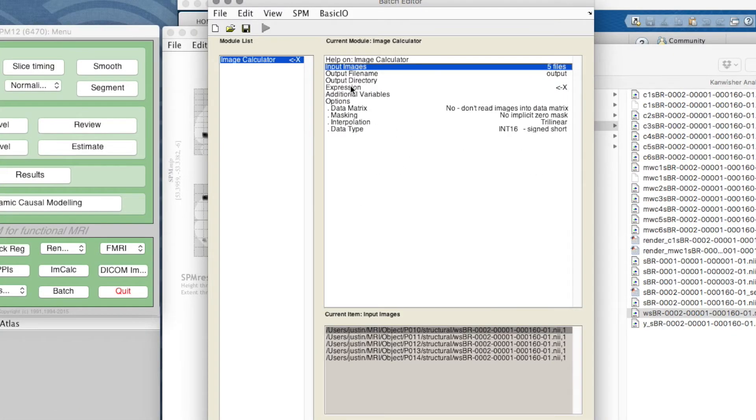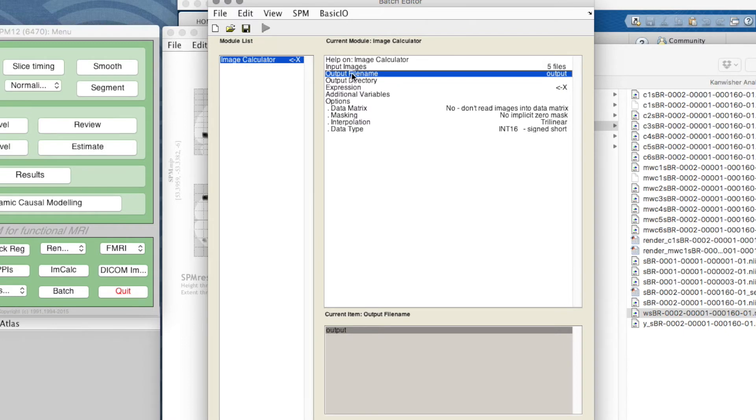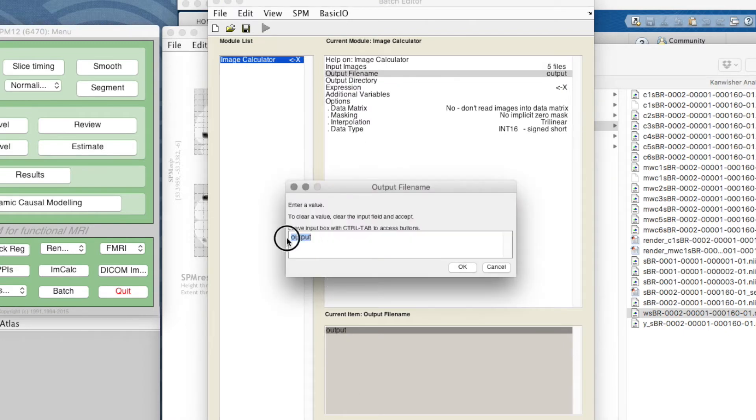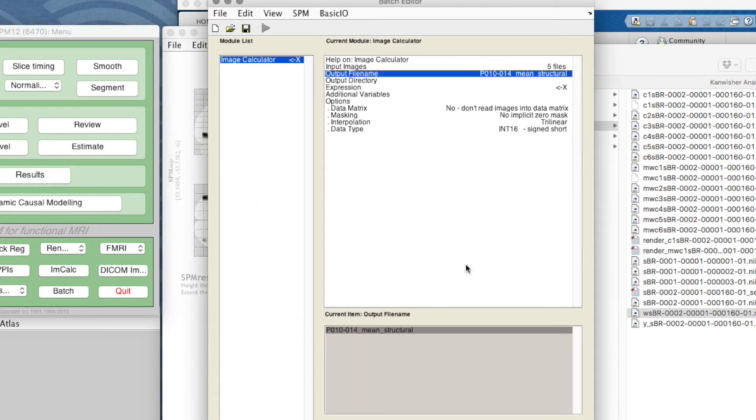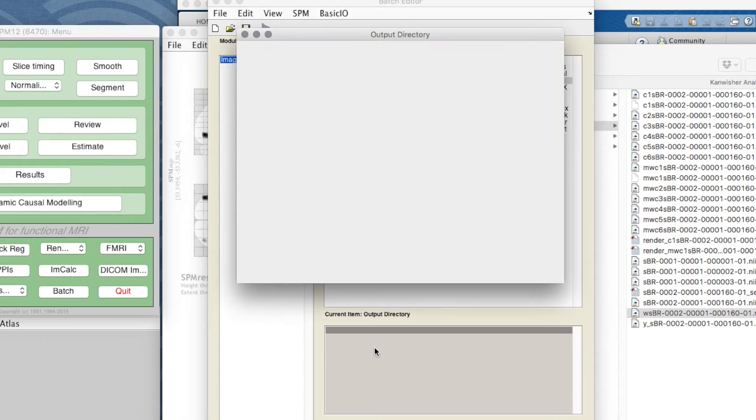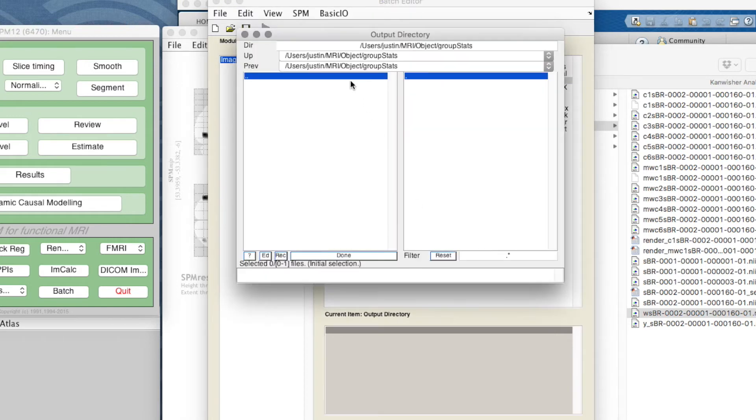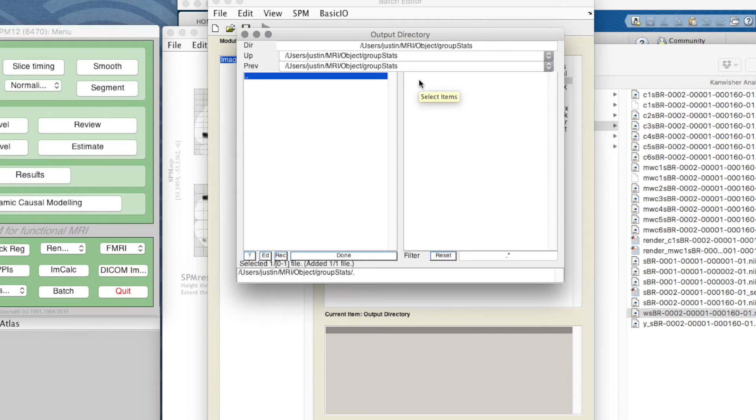The output file name just says 'output', so I'm going to change that. I'm going to call it p10 to p14 mean structural. The output directory - I think the best place to put it is actually group stats because that's where we'll be overlaying. I just clicked on that single dot to select that directory.